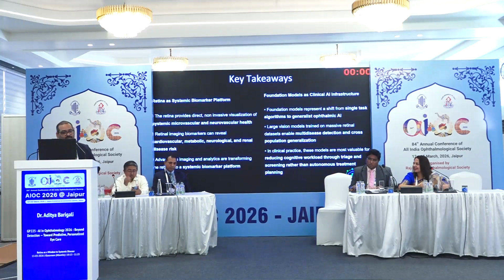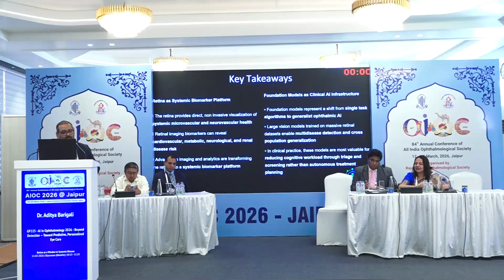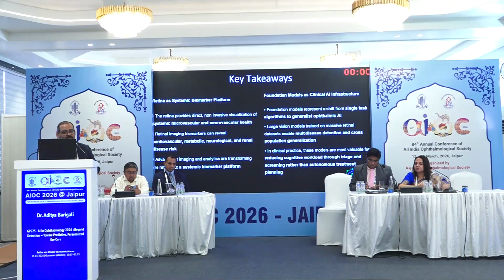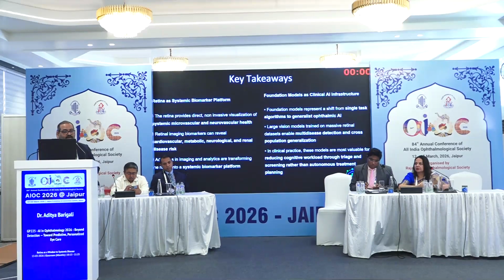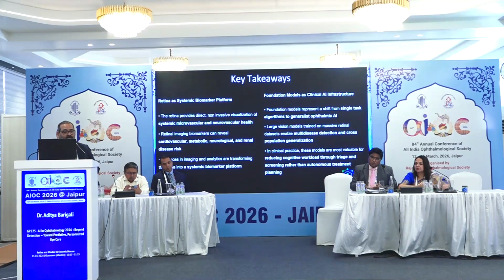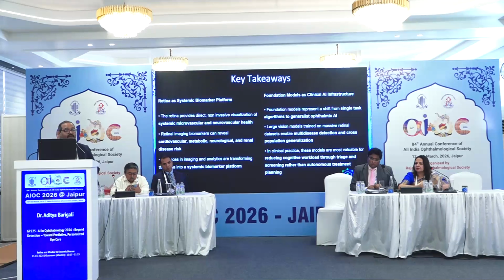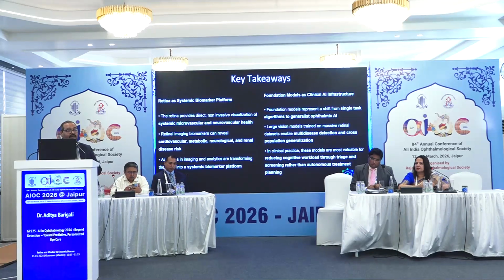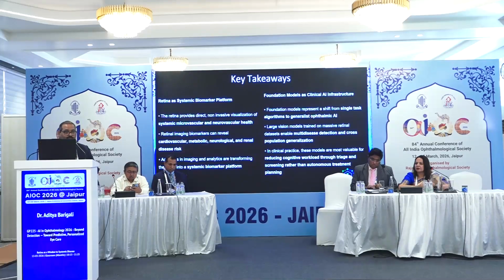The key takeaways from this are: the retina, as we all know, provides a direct, non-invasive visualization of systemic, microvascular and neurovascular health. Retinal imaging biomarkers can reveal cardiovascular, metabolic, neurological and renal disease risk. Advances in imaging and analytics are transforming the retina into a systemic biomarker platform.